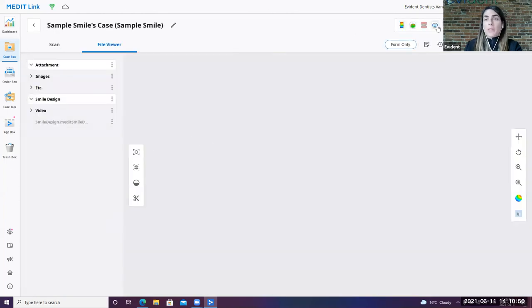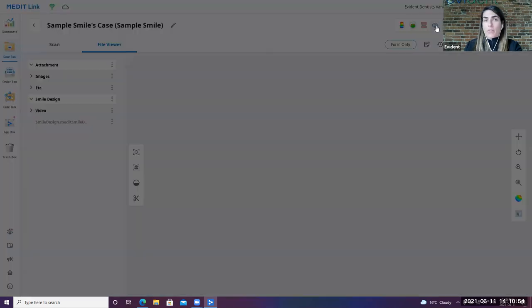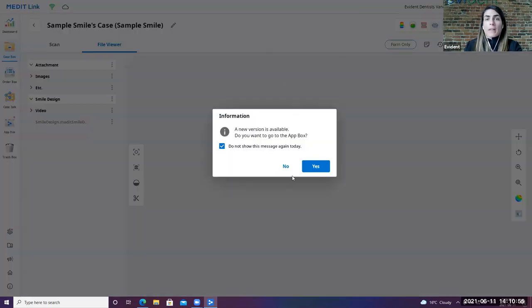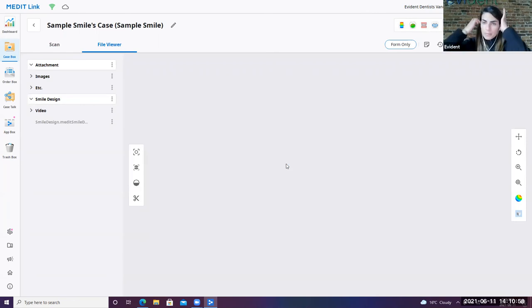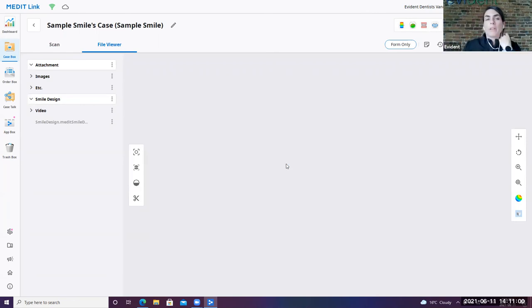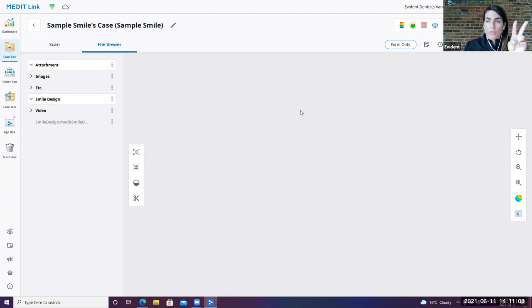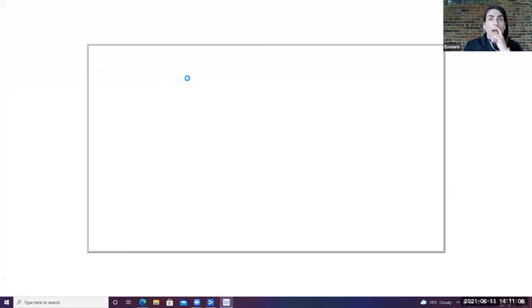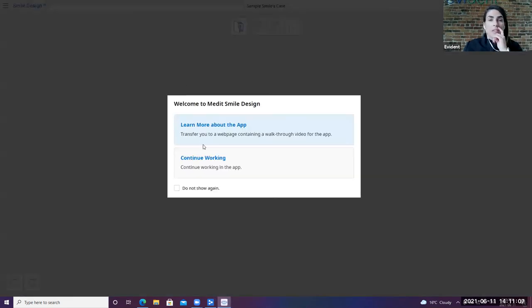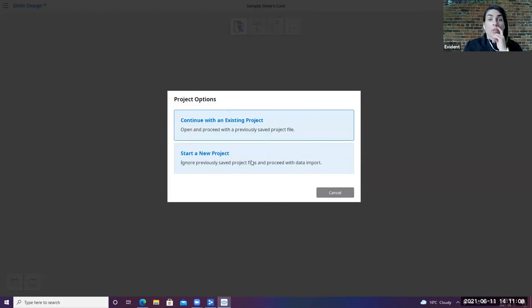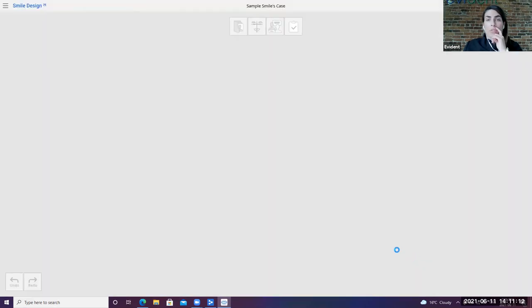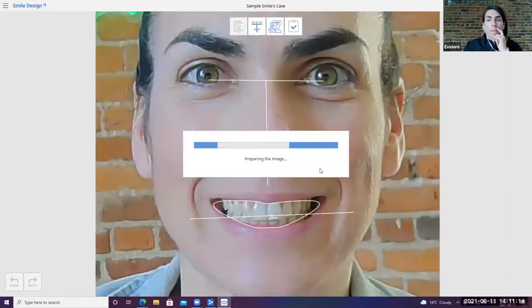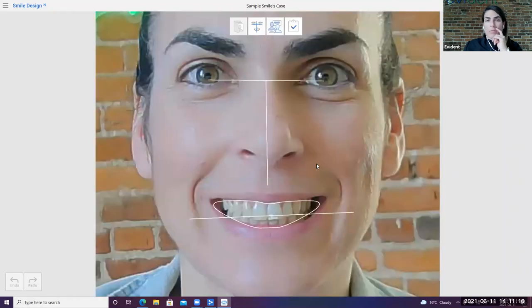So this is one of the modules that we have. So I have a case here that I've got created for sample smile. So typically with a smile sample, you should have two different files. You should have a regular smile, and then you should have a retracted smile. In this specific example, I do only have just a regular smile, but it will allow me to at least show you what the interface looks like while we're waiting for that case to process.